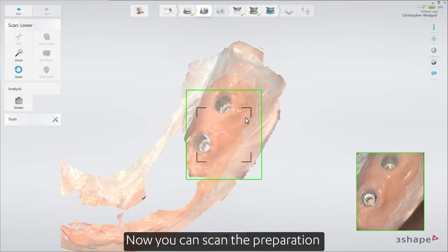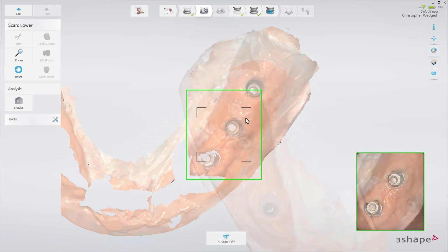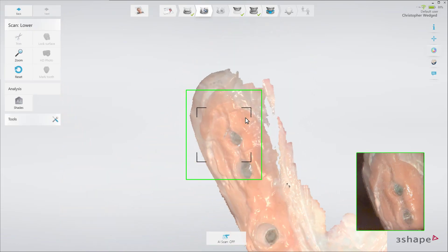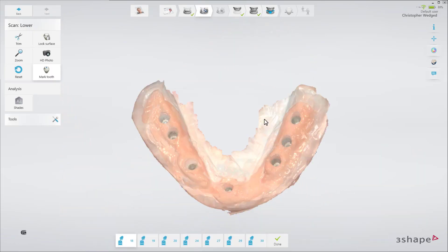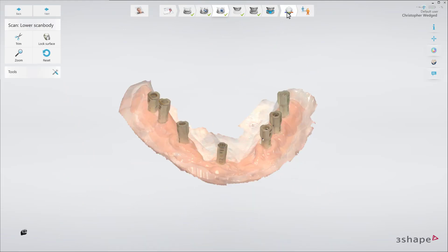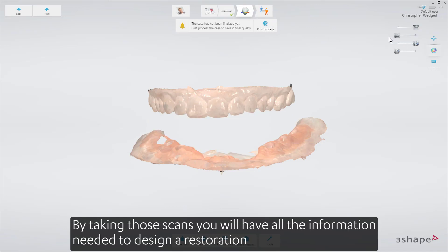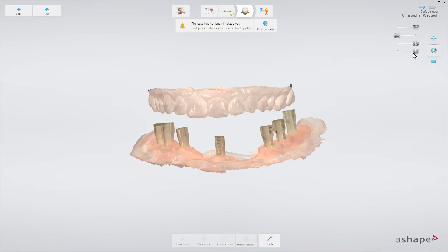Now you can scan the preparation and scan bodies for an implant restoration. By taking those scans, you'll have all the information needed to design a restoration.